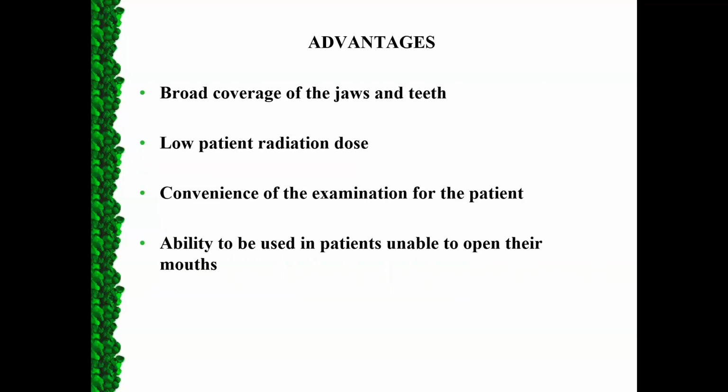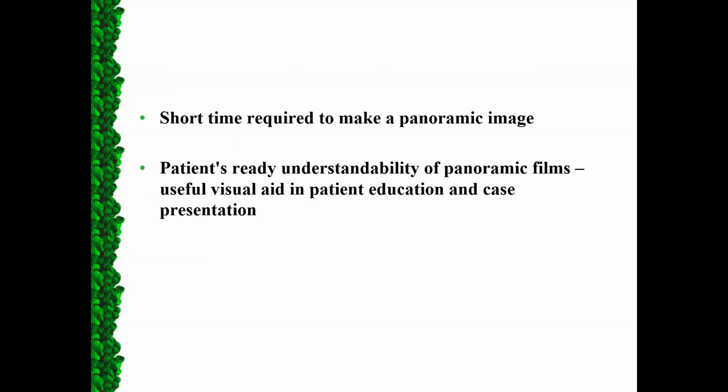Its advantages include a broad coverage of jaws and teeth, making it a perfect screening imaging. It has a very low patient radiation dosage. It has the convenience of examination of the patient, and it has the ability to be used in patients who are unable to open their mouths, for example, in case of trismus or a locked jaw, or if there is a trauma-induced inability to open the oral cavity.